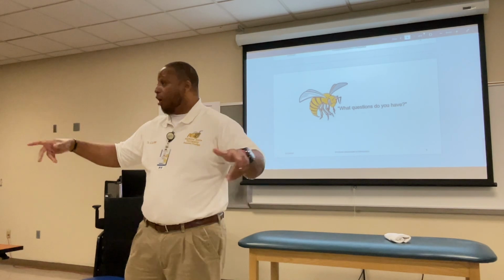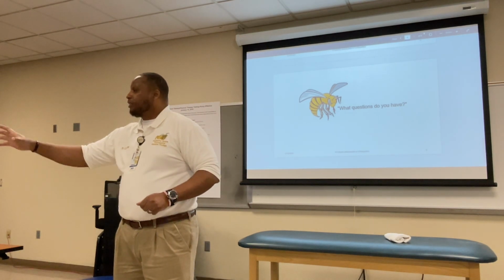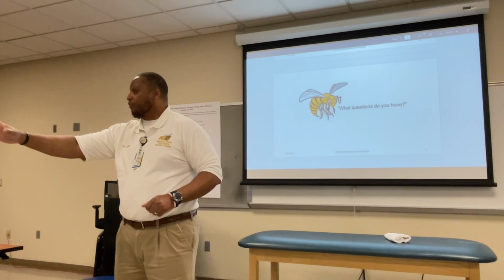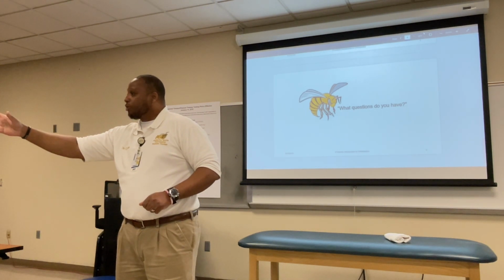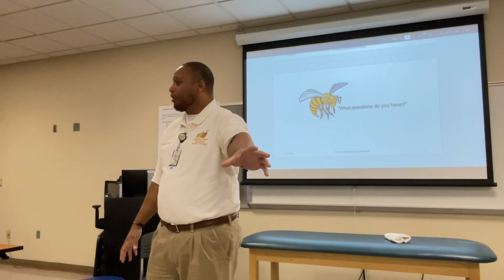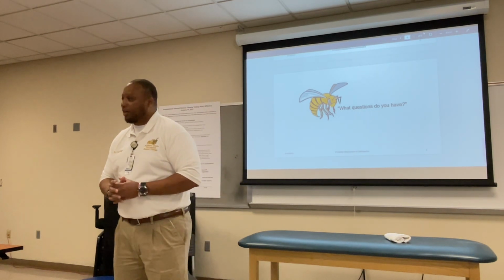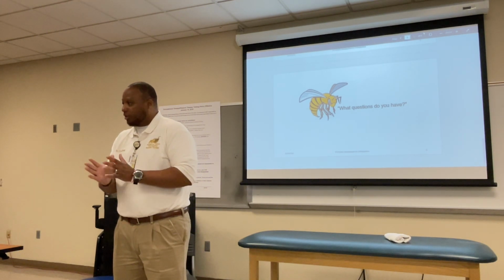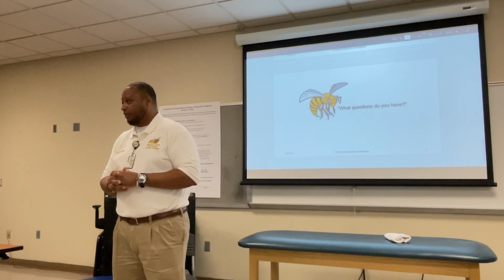But say all of you all, say Tatum gets 0 to 121, you get 0 to 125, Liz gets 0 to 120, and say Acacia gets 0 to 123. Is that inter-rater reliability? Yes, that's inter-rater reliability because you all are just a few degrees different. Okay, but that's a good question.